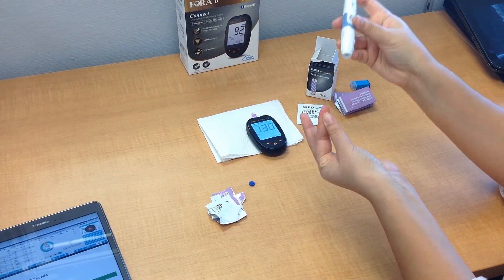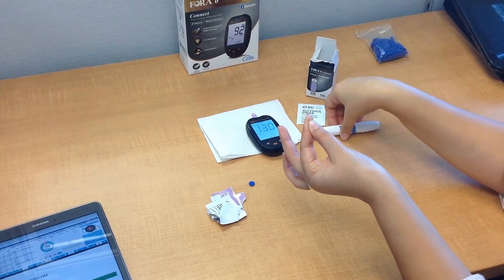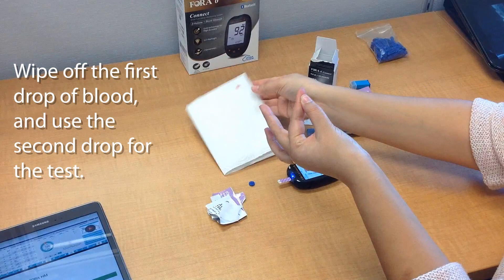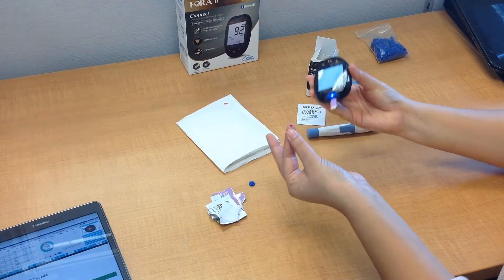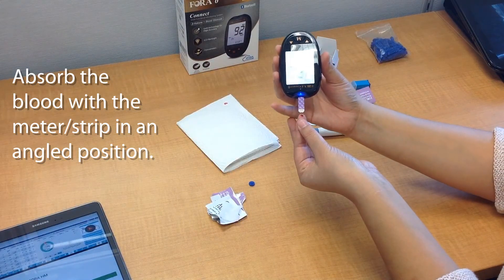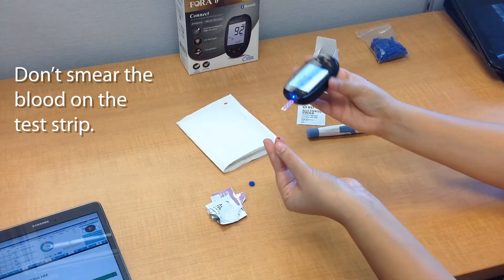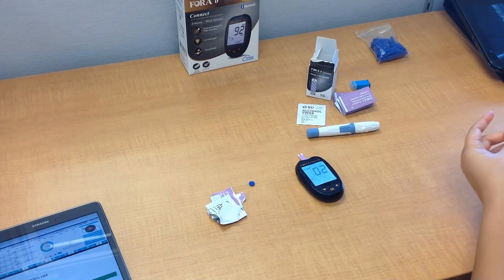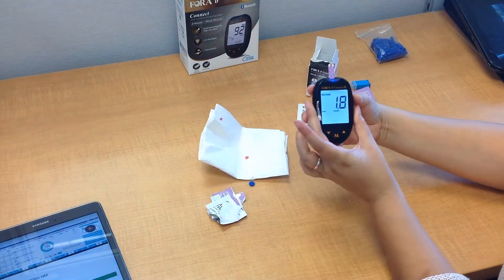Press up — now it's nice and red. Put the pen on the site and press the ejector button. You want to wipe off the first drop because it may have some contaminants — for an accurate result, use the second blood drop. Then take the device and the strip, and at an angled position, put it lightly on the blood drop so that it absorbs. Make sure you don't smear the blood. The device will count down from 10 to 0, and at the end of the countdown the result will show on the screen.